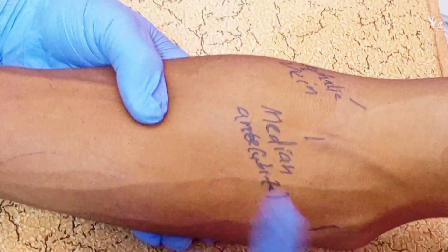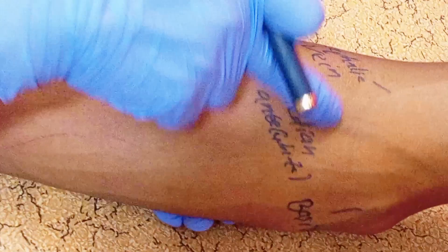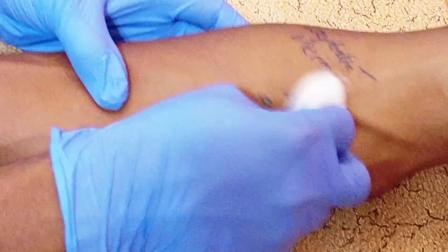To draw blood, the best suitable vein is the median antecubital vein — we shall draw from this one. Before you start, make sure you have all the necessary equipment: the butterfly needle, a 10 ml syringe, cotton wool to apply pressure after the shot, and alcohol swabs to clean the vein.